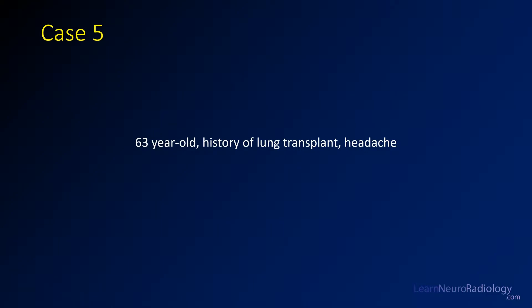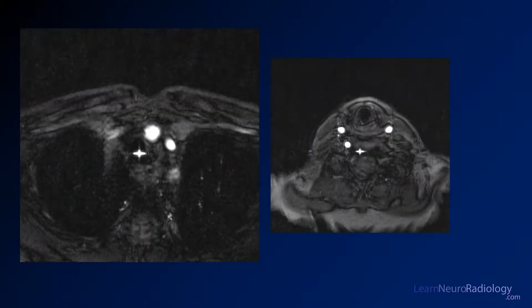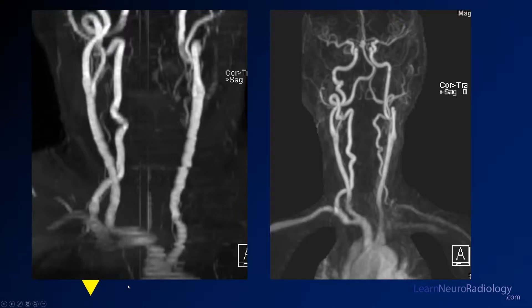Case 5 is a 63-year-old with a history of lung transplant and headache. Here are some images from an MRA. I'll go ahead and tell you to ignore this star-shaped artifact in the middle of the image. Here are some projectural images from that same study.